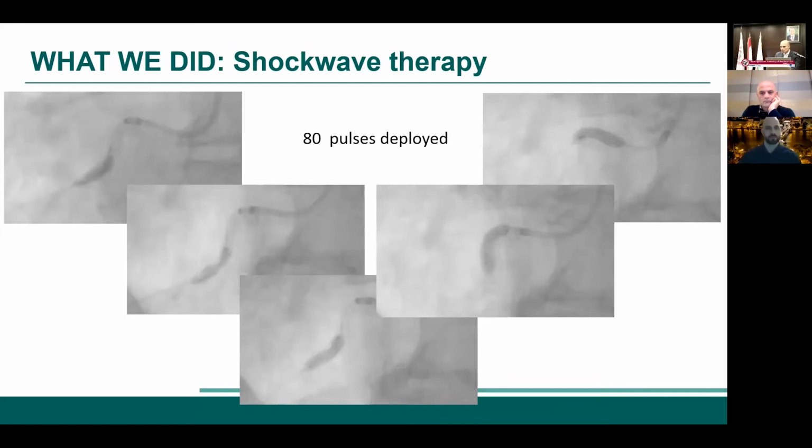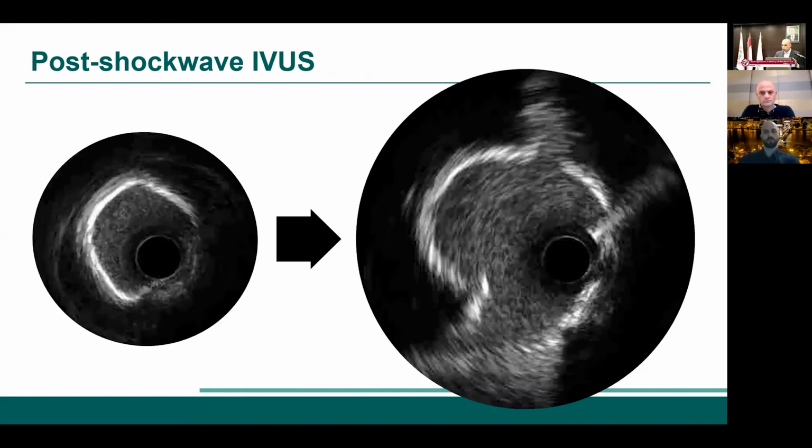And before anything else, as we were just saying, full agreement with what was mentioned before: before you get your stent, whatever you use as calcium modification, get a balloon and make sure the balloon expands, or better, also image, and do both ideally. Image, know what happened. And here's our image. We have clearly at the area a crack in the calcium. Remember that calcium that was almost circular? There was a crack in the calcium.